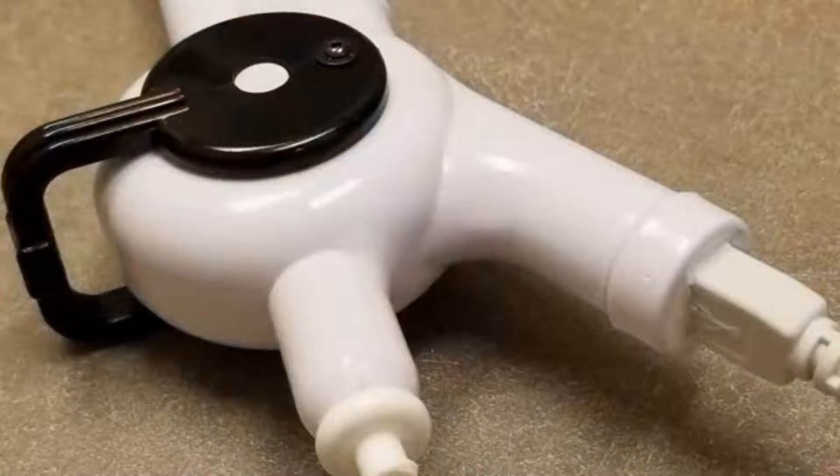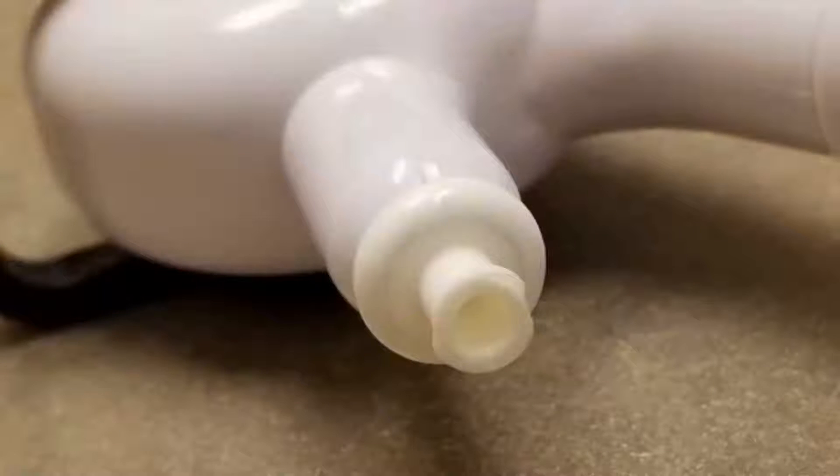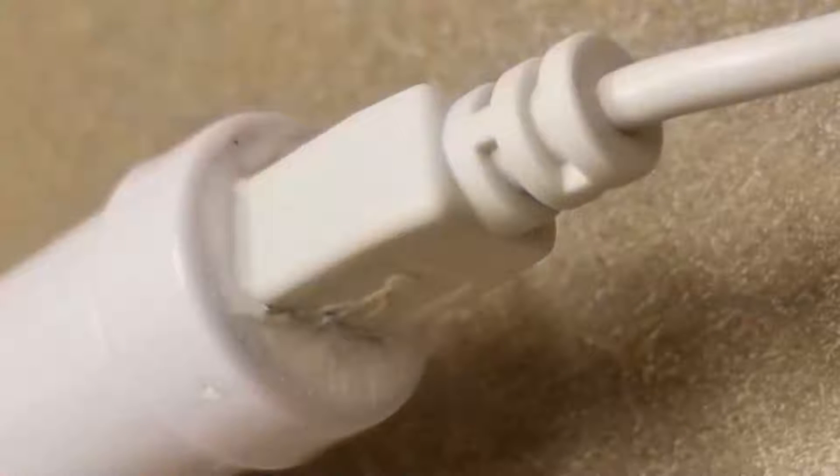The handle has an interesting articulating control that is black and sticks way out from the body of the scope — I'm used to having the adjusting handle much closer to the scope. Towards the back of the scope there is a lure lock with a straight inline entry to the working channel. The other end of the scope has a USB Type-B connector that looks somewhat sloppily glued or epoxied in place, which is notable.